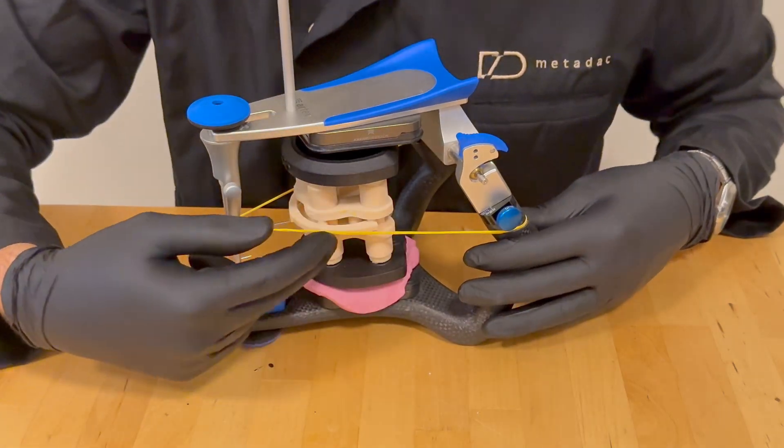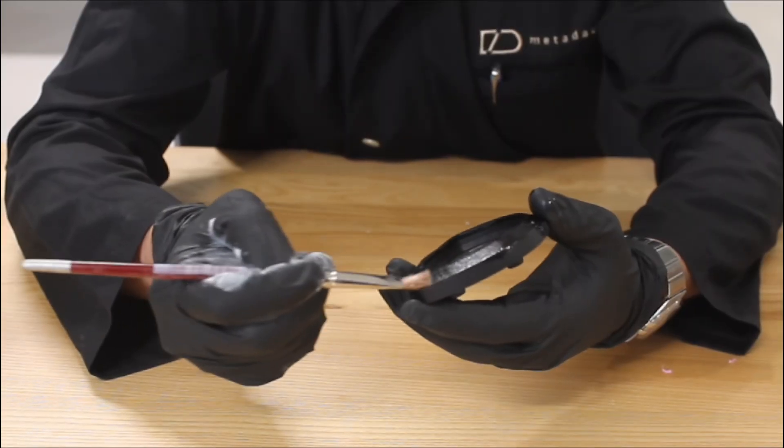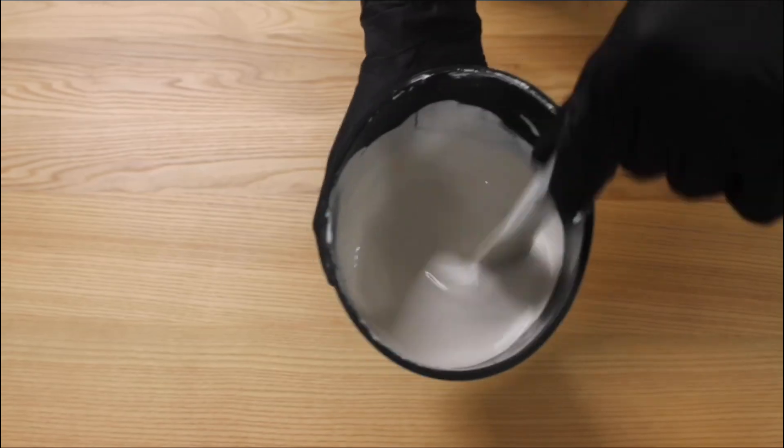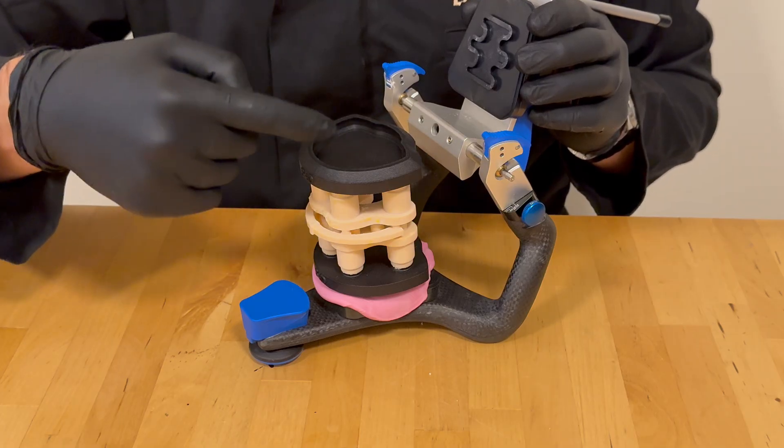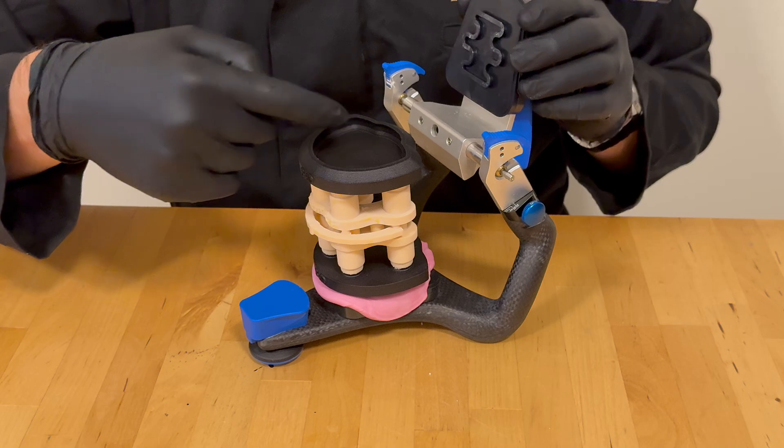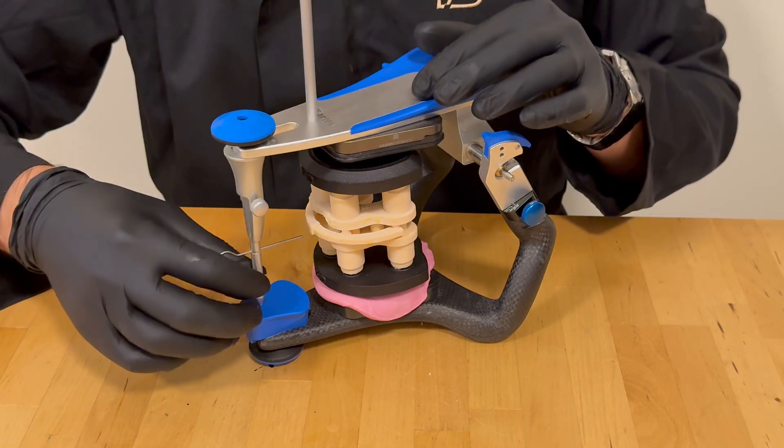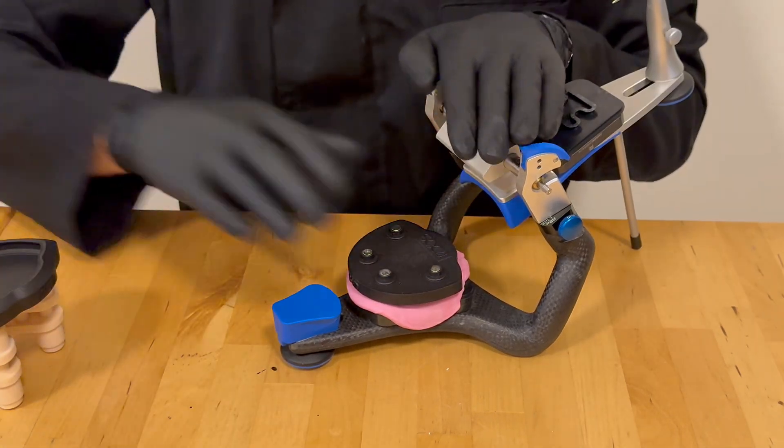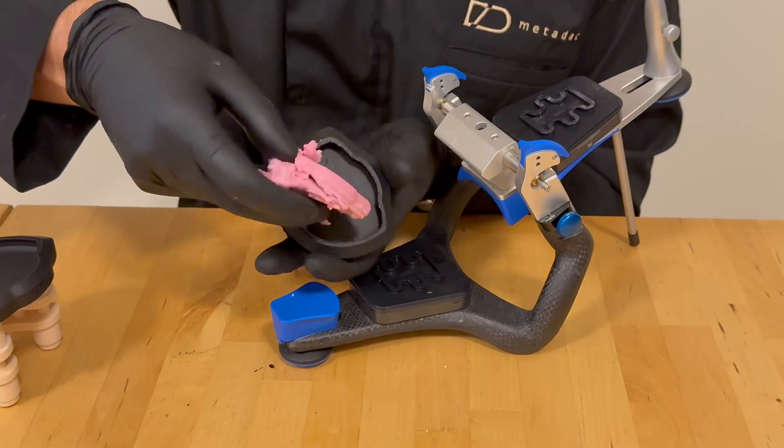Before applying plaster, use Vaseline to prevent residue from sticking to the DACOS plates. Then mix the plaster and begin securing the upper DACOS plate. Once the plaster has set, approximately 30 minutes, remove the temporary silicone and proceed to install the lower DACOS plate.